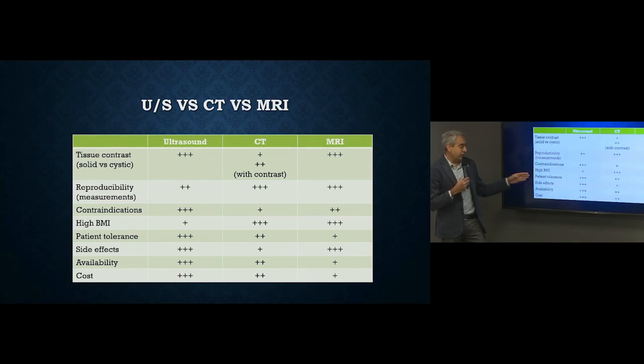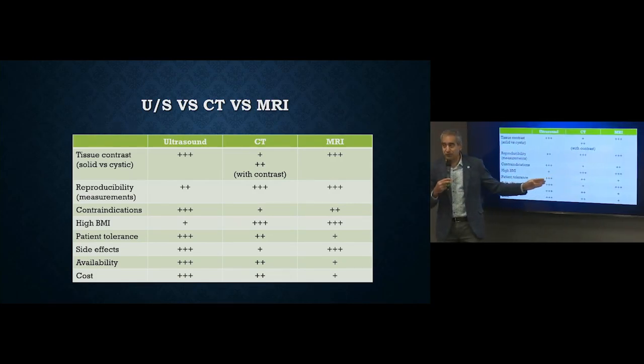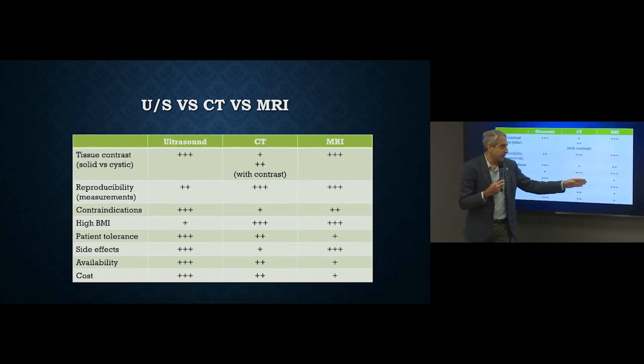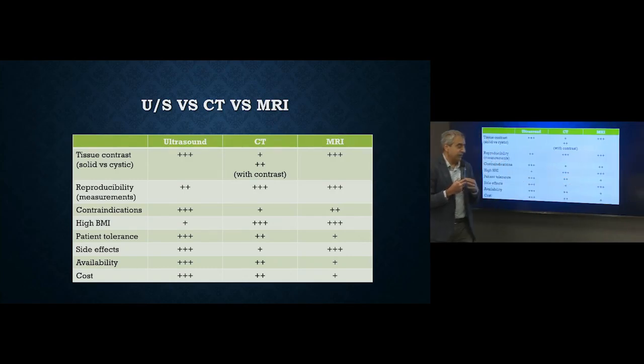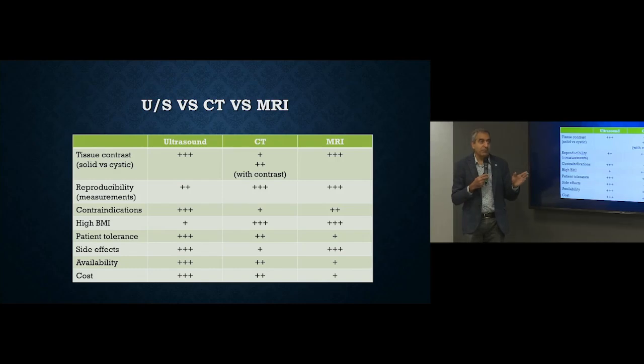In terms of patient tolerance, patients have no trouble with ultrasound and generally not much trouble with CT, although most patients don't like to have that injection. And with MR, you need to be in this strong magnet, and some patients, let's say, are not great fans of getting in there. Most people can tolerate it fairly well, but preference-wise, it's not something that people prefer.